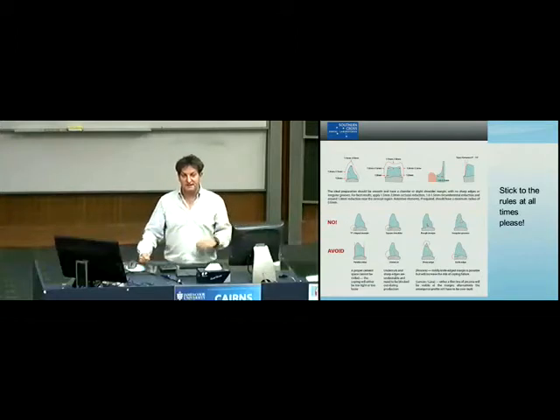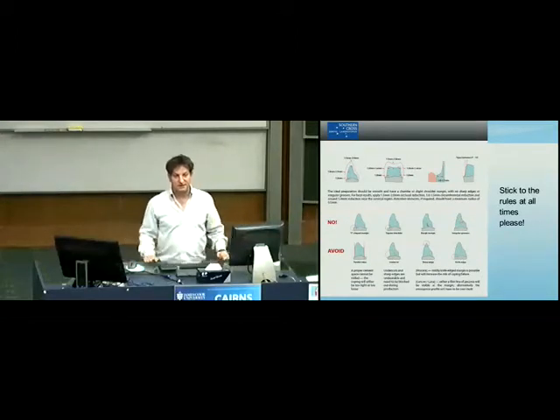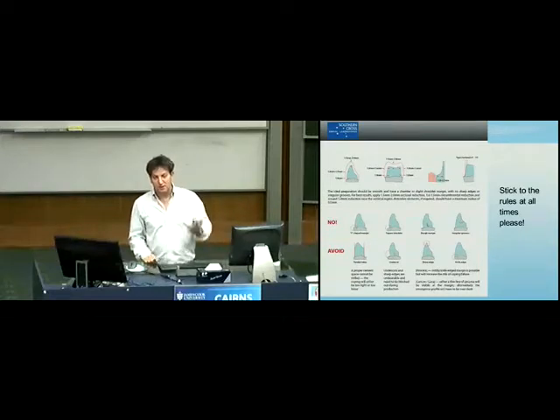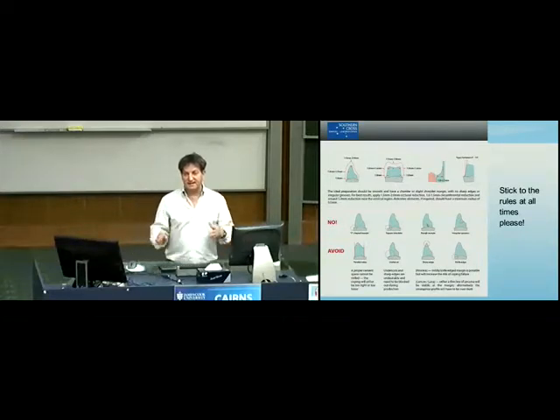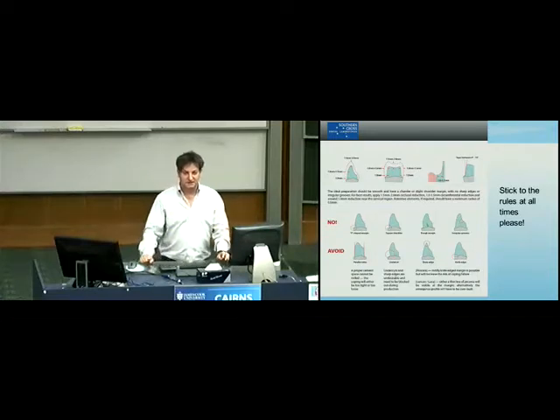And I'm serious. I've seen dentists, they go like this. Pull the impression out, put it in the thing, we'll make the temporary. They don't even look at it. They don't even wash it. Wash it out, dry it out, get some magnification. And again, look at it carefully. You can see the bicycle track, that's fine. If you can't see all of it, if you can see most of it, that's probably reasonably good. But if you can see there's big chunks missing, that's disturbing.